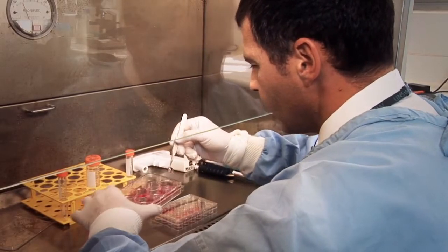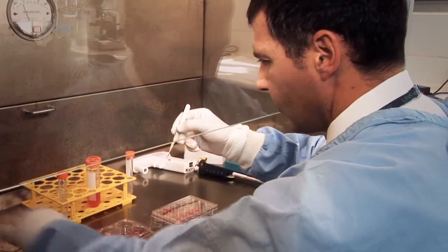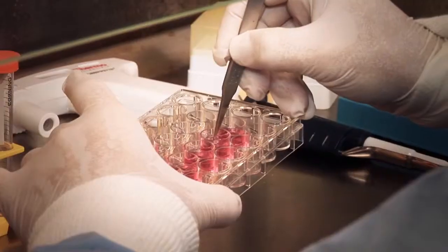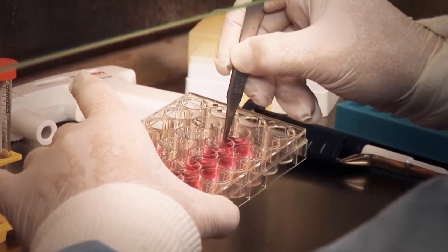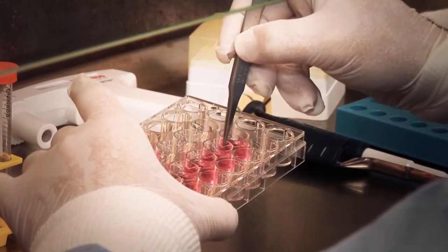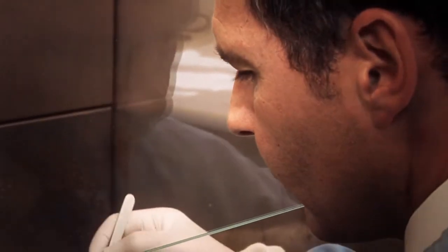During the culture procedure, the tissue is firmly adherent to the contact lens surface. The pink solution is like fertiliser for the cells. The cells seem to transfer from the contact lens surface onto the patient's ocular surface.